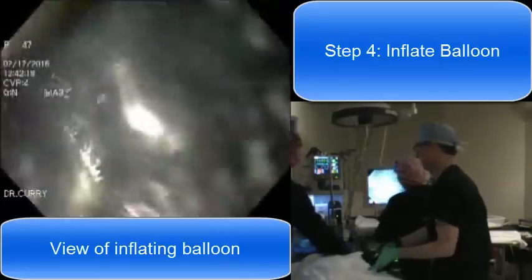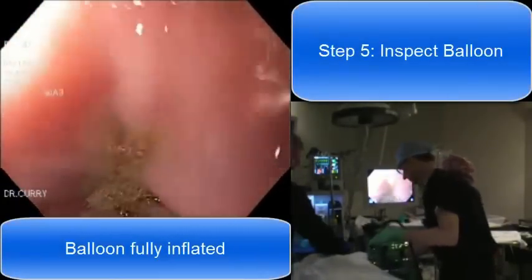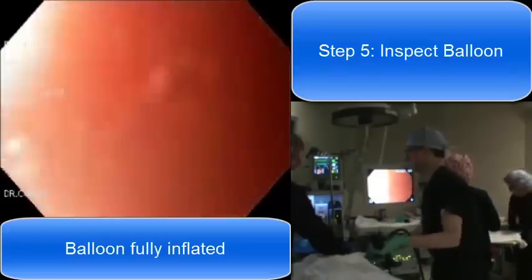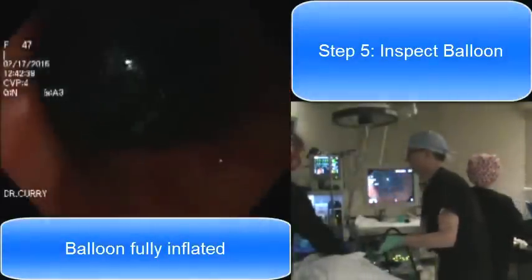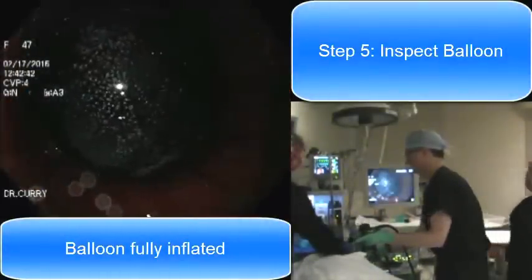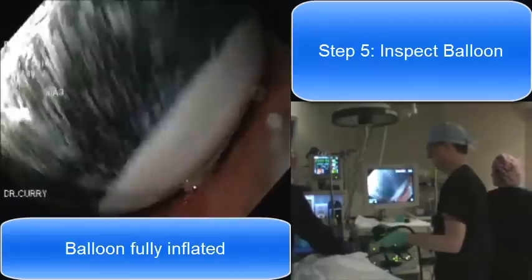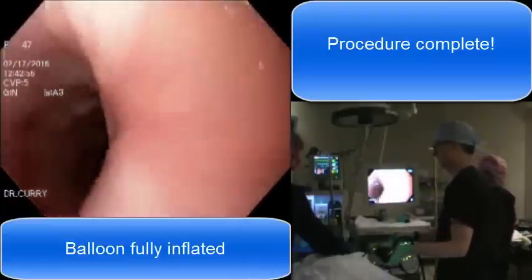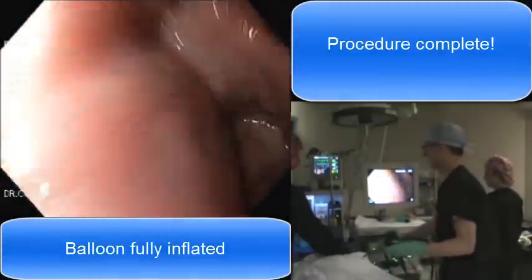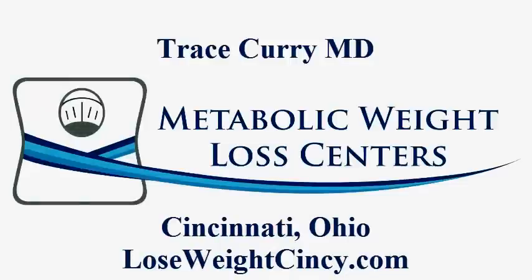We're just about done inflating the balloon — it looks to be fully inflated. We pull the scope back a little bit and tug on the catheter gently. There's a valve in the balloon that will remain sealed, so we pull the catheter out. Now I'm looking at the balloon freely floating in the stomach. I'll go past the balloon and retroflex the scope back so we can see it and make sure it looks like it's in good position with no evidence of leakage. Everything looks really great. We withdraw the scope and that's it. The patient's been sedated the whole time, the whole procedure took right around five minutes, and the patient will wake up quickly and be able to go home in about 20 or 30 minutes. For more information, check out our website at loseweightcincy.com.